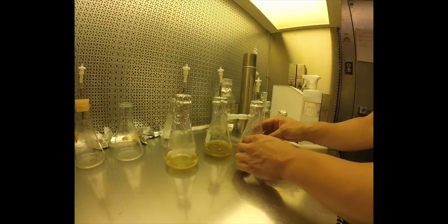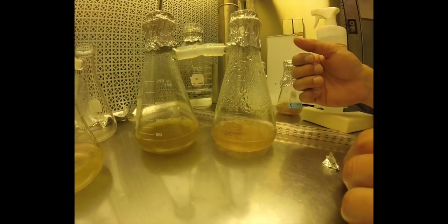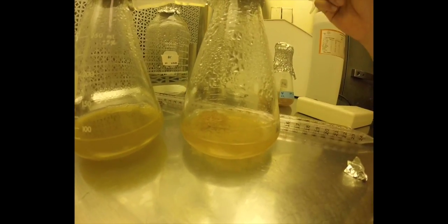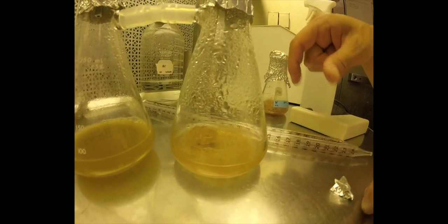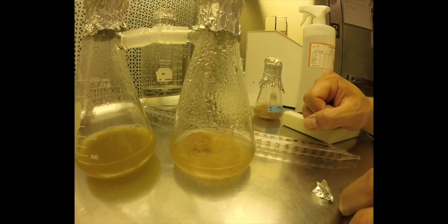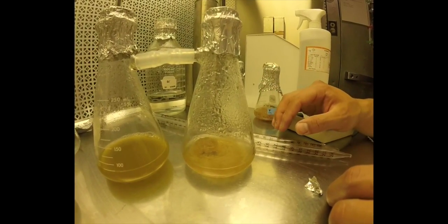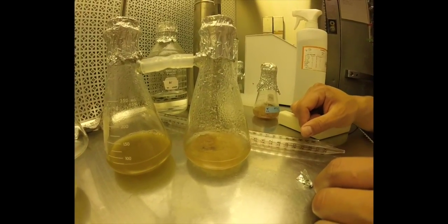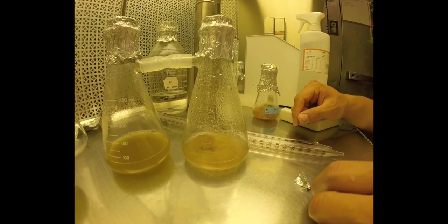If I were subculturing this flask, what you could do is drain out all the old B5 in here and just try to take out the roots. Generally they stay intact, so if you use a pair of forceps and just grab it out, trying to maintain sterile or aseptic technique, then you should be able to get most of it out, replenish the B5 and put new roots in it, or leave the roots in if they don't look too old.